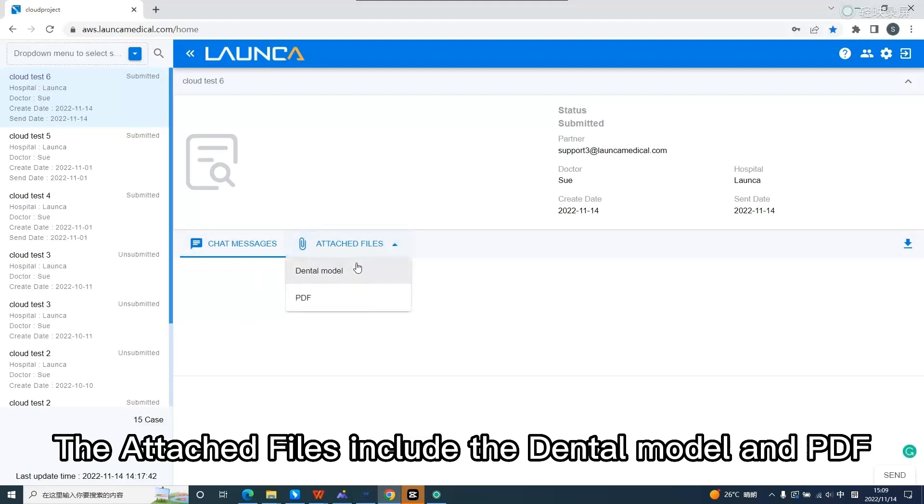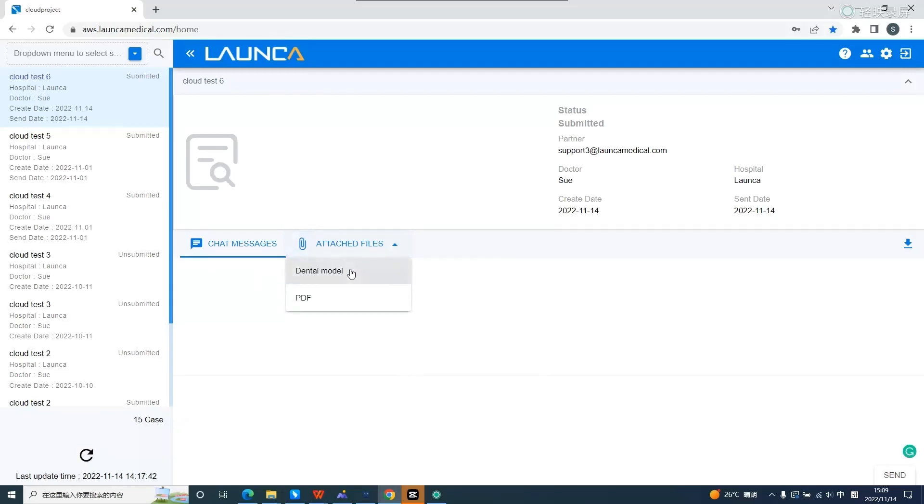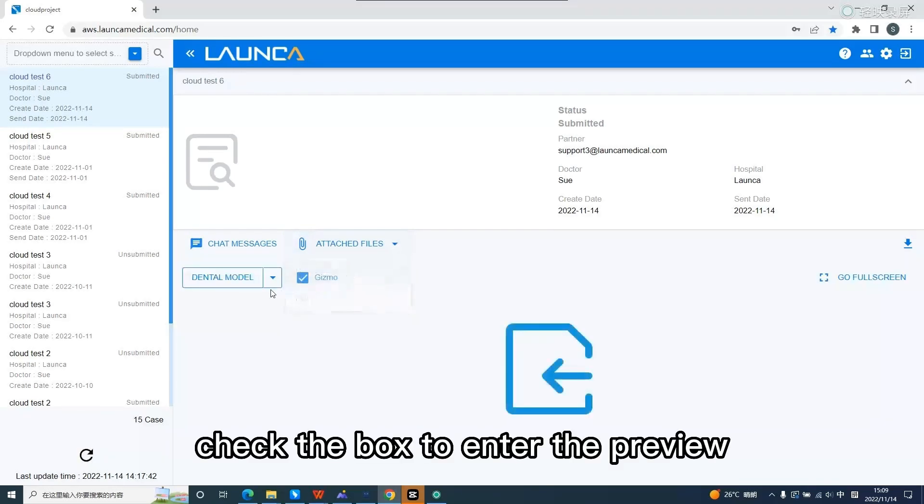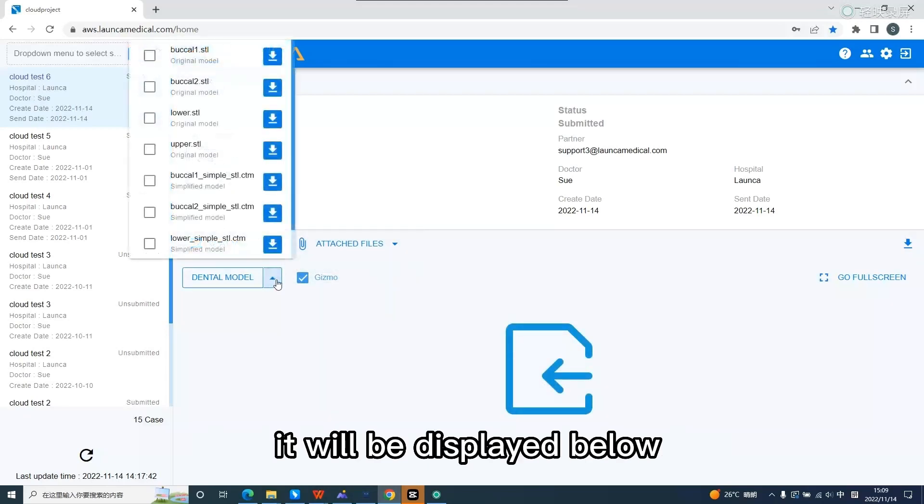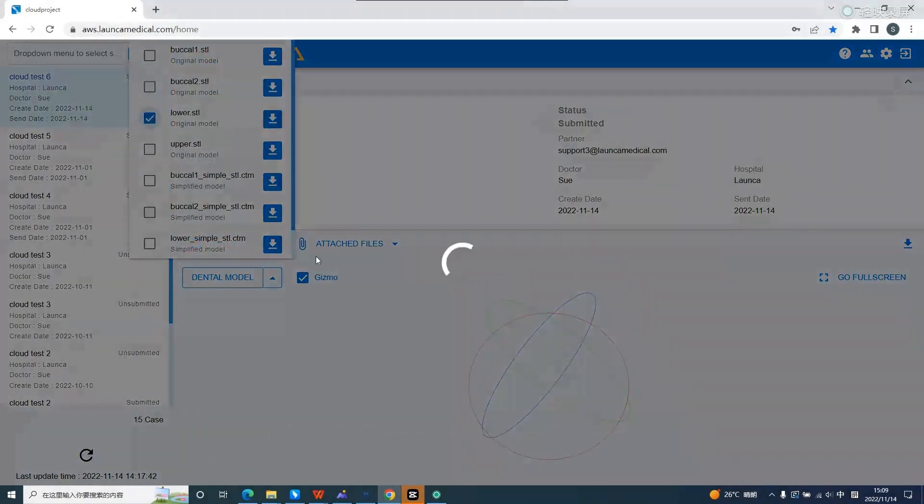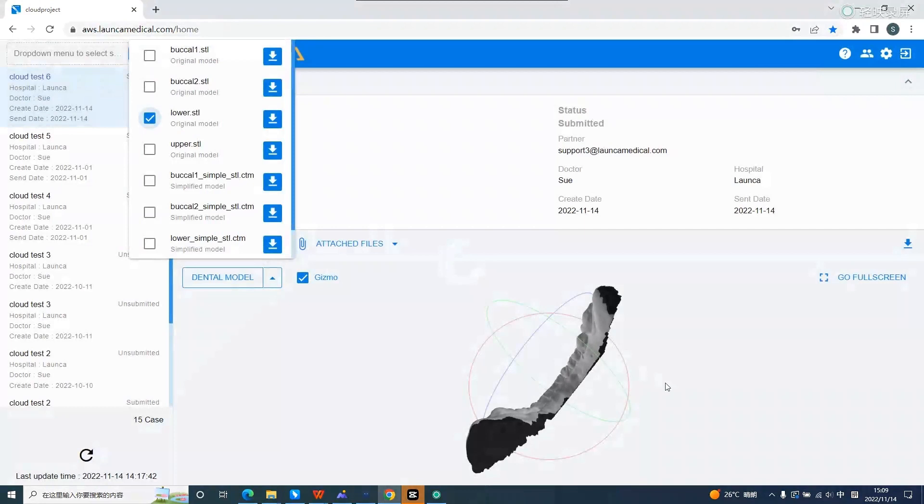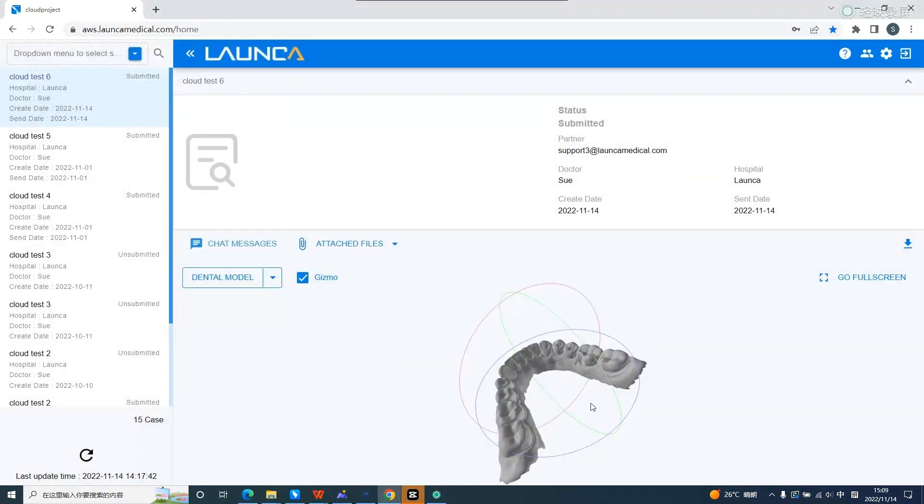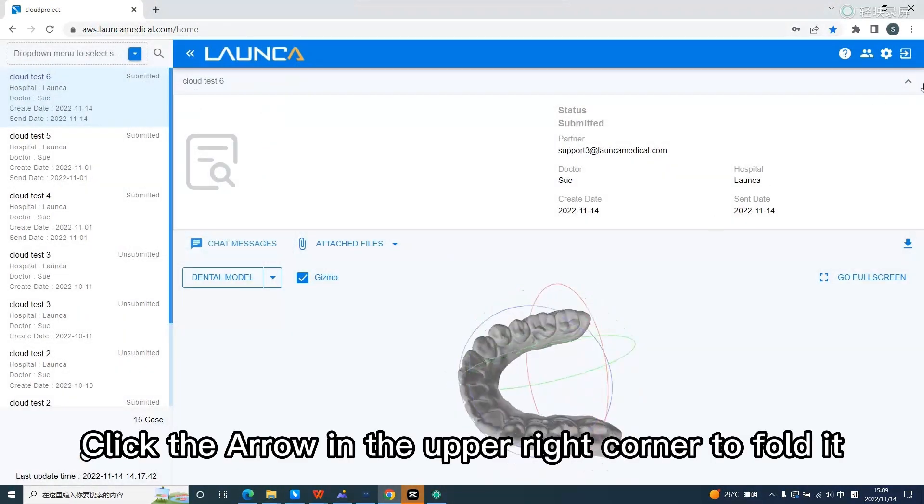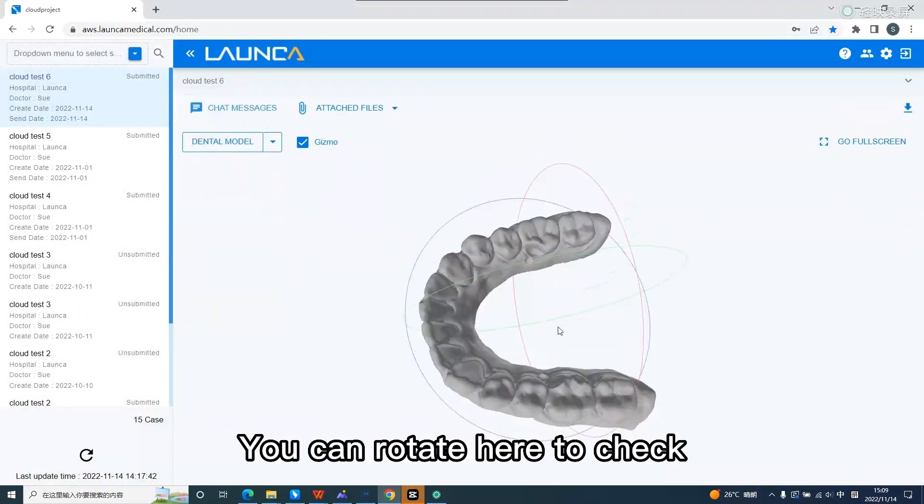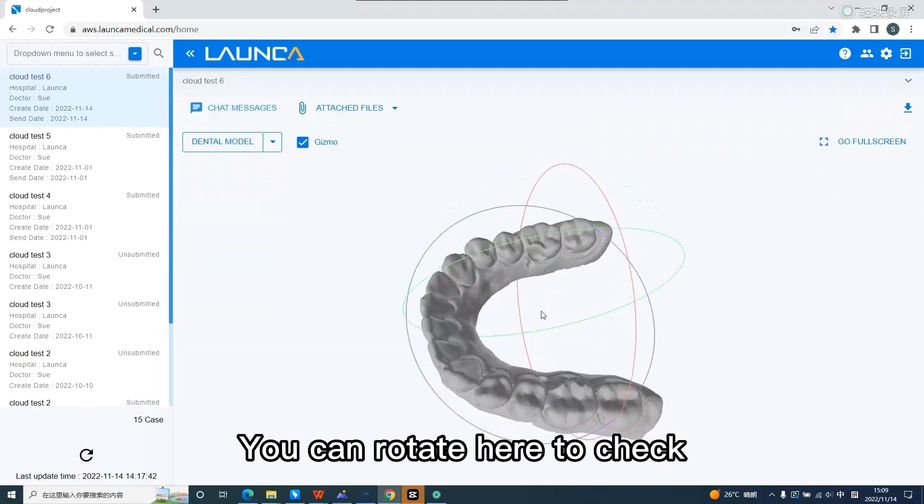The attached files include the dental model and PDF. Click on the dental model. Check the box to enter the preview. It will be displayed below. Click the arrow in the upper right corner to fold it. You can rotate here to check.